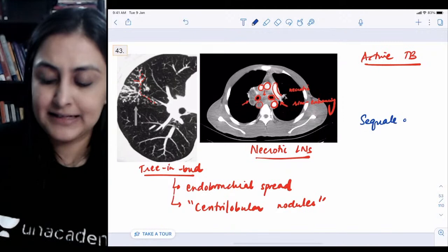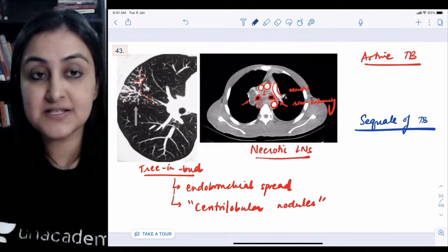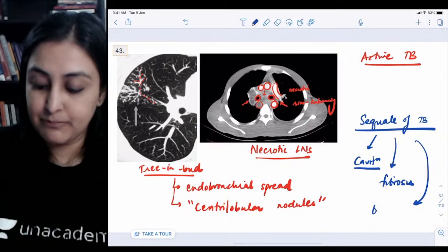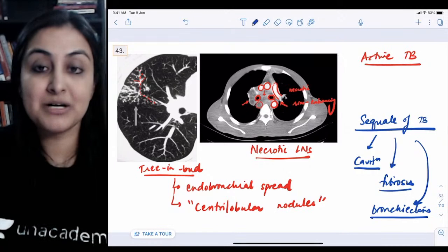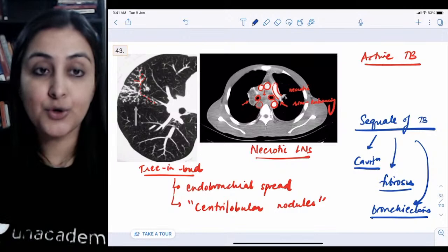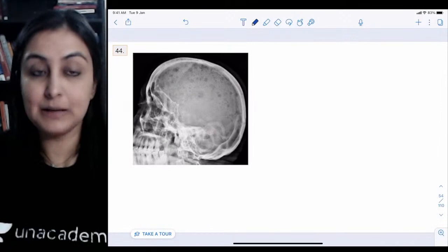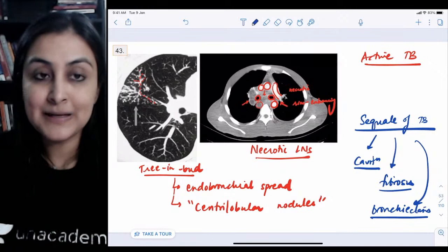As a side note, sequelae of TB — indicating past but not active disease — include cavitation, fibrotic changes, and bronchiectasis. These do not indicate active TB but rather chronic or healed tuberculosis. Understanding the difference between active TB and its sequelae is very important. Miliary TB, covered in a previous image, indicates hematogenous spread.